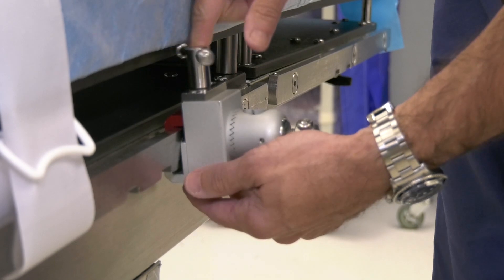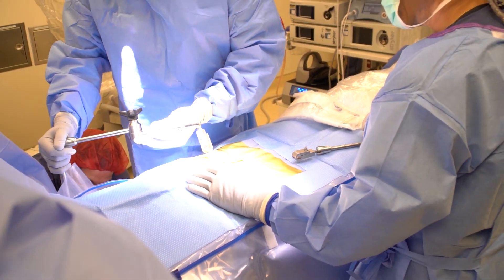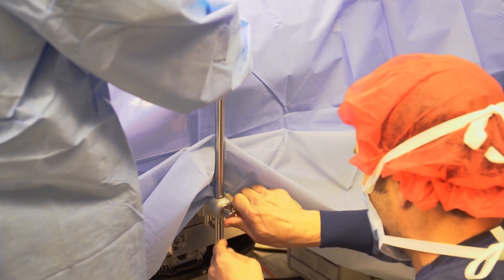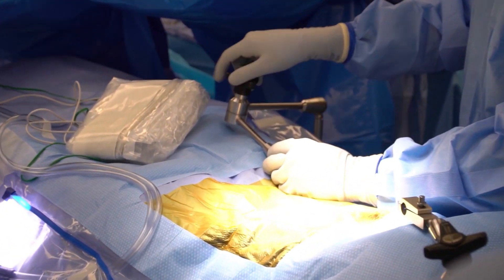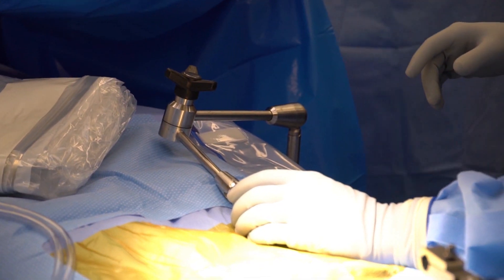For placement, you place the other one next to the armpit on this side. The next step is to place the post. You want this arm far enough down that you create as much of a straight plane of this retractor. This top one is not so important — you're usually going to have an angle at that — but this one you want as straight as possible.